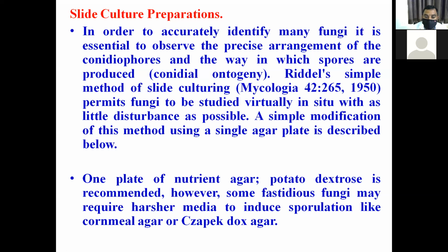Then the exact morphology of the fungus will be read. There are no disturbances. Morphological details of fungi, relationships between sporangiophore, sporangia, or conidia, conidiophore, and hyphae, maybe septate or non-septate hyphae. We will read the exact morphology in slide culture preparation. In LCB, some loss will be seen.